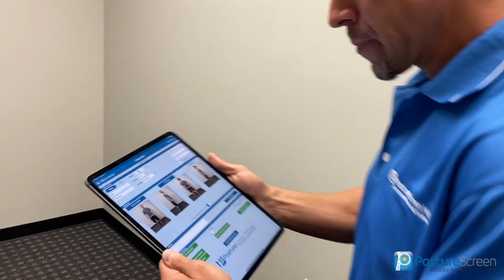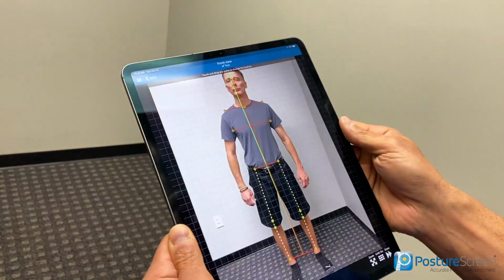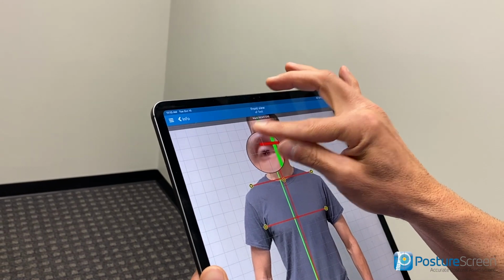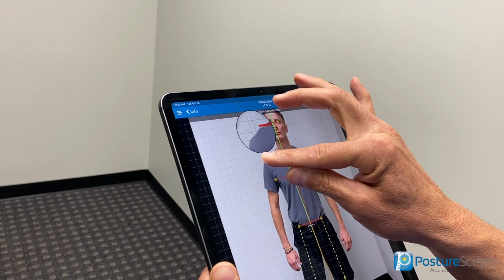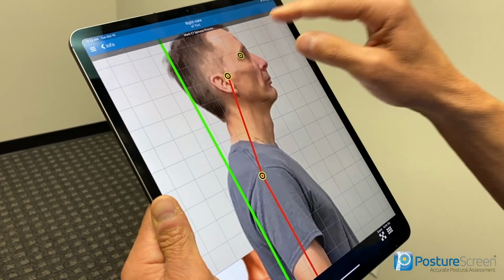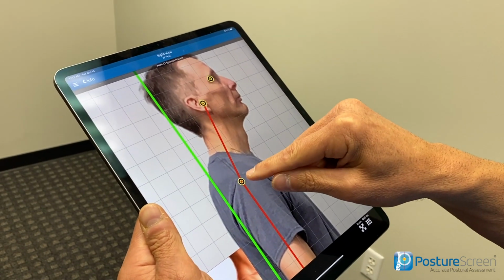But I have turned those on, and we're gonna have to manually click some points on that. So let me go ahead and show you how that works. I have the assessments already done here with the photographs captured. We're gonna hit begin posture analysis. Everything looks fantastic here. Again, like I showed in the other video, if I wanna change anything, like if it missed his eyes just a little bit, I can move this down just a little bit. I can move the shoulder down, just to show you that we can do this. Now, obviously, if we have the shirt off, that's much better and a little bit more accurate. Same thing here. We're gonna move this down just a little bit right to the EAM. If we wanna adjust anything else, we can.